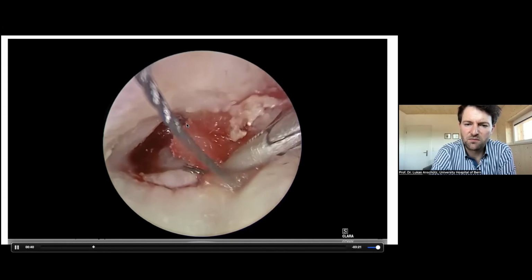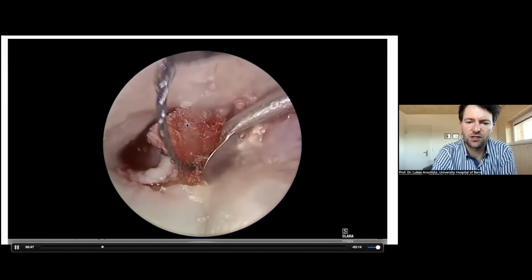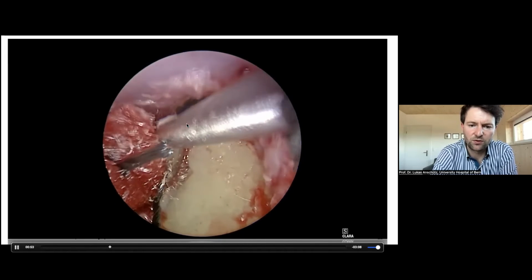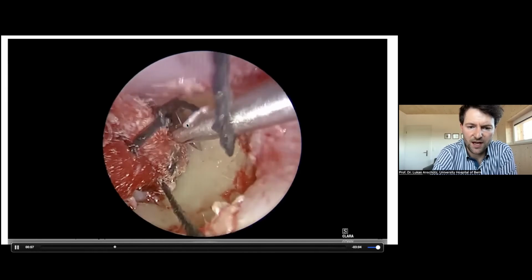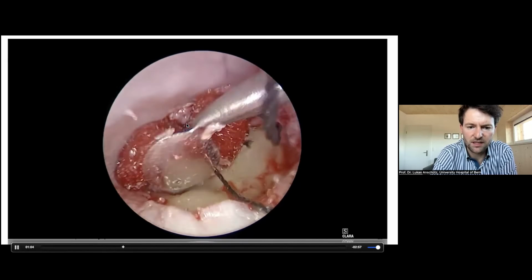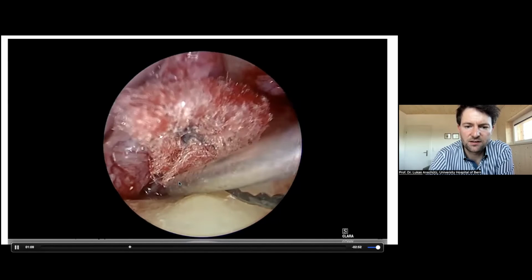You can see it's a bit more bloody in this patient. He has active inflammation. He has otorrhea, really a bad discharge from his ear all the time. And now we can follow the bone and come to where the first surgery happened. He had some fascia graft initially. You can see the annulus is not very well depictable anymore. You can see here a little bit of glue coming out. It's really not a nice ear.